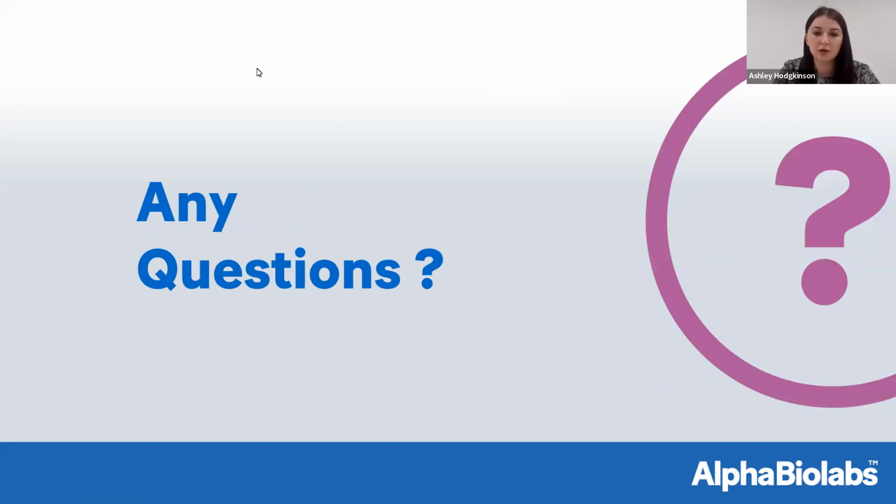Yeah, we've had a few come through actually. Some of them are exactly the same, which is great, and something that I didn't actually cover. So the main question that's coming through more than once is about the length of a nail sample for testing. So what is required from each client? So with testing that we do here, we always take 2 samples as a minimum, an A and a B. The A is tested in the laboratory and the B is kept on record in case there's a dispute.